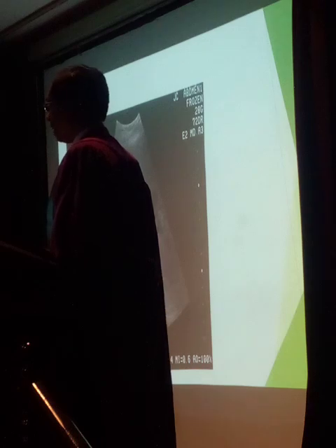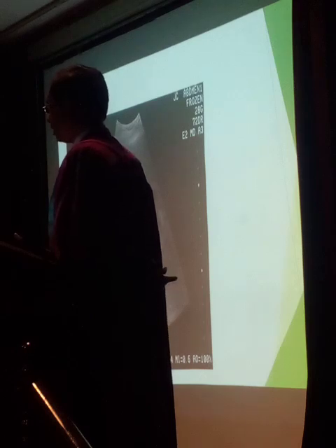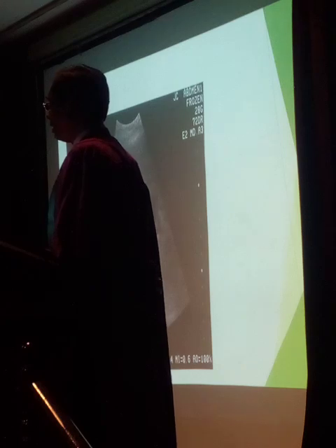One is actually the pancreas. So if we think it's a pancreatic metastasis, we turn the patient to various positions and look at the pancreatic head, neck, body and tail, because the tail is located close to the spleen, so we can see the tail through the spleen, then through the left lobe of the liver. So these are examples of pancreatic metastasis.